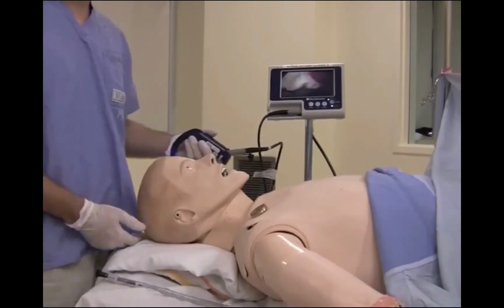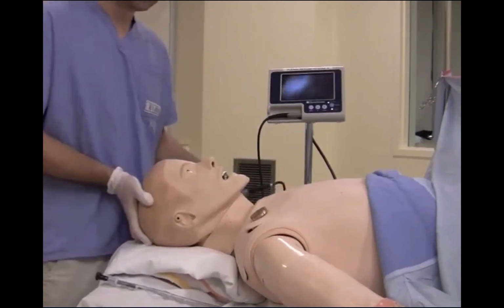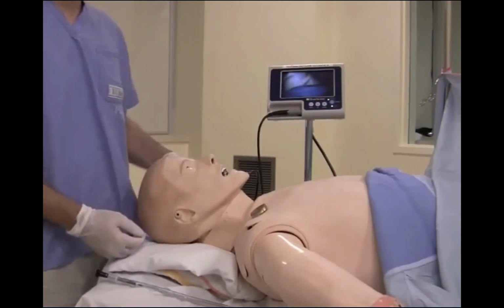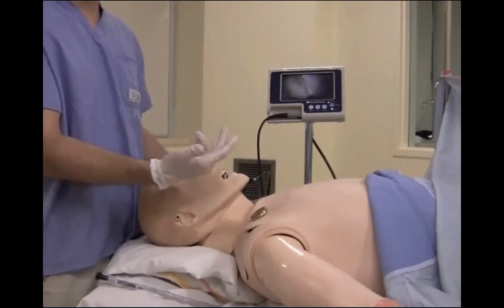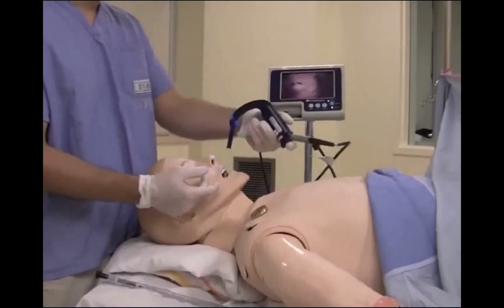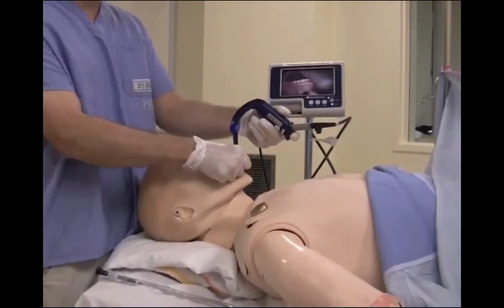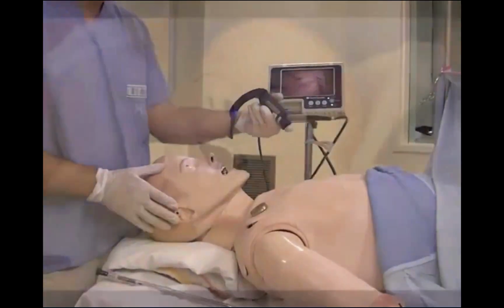For insertion of the Glidescope, you'll be required to open the patient's mouth. And this can be done by a couple of techniques. The first technique would be to grab the occiput with the right hand and to increase the extension at the AO joint. This will naturally open the patient's mouth. The other technique is called the scissor technique, using your thumb and your middle finger of your right hand. As you can see from the screen, I cross my fingers over and scissor them out to open the patient's mouth even more.